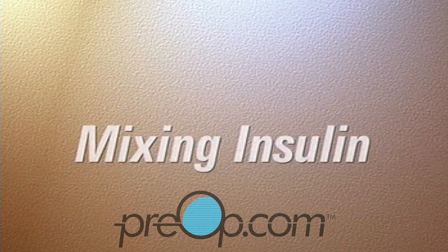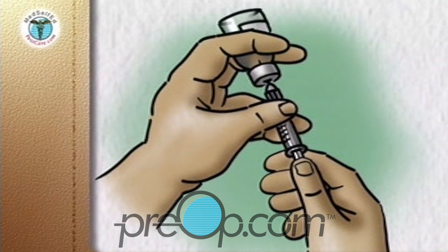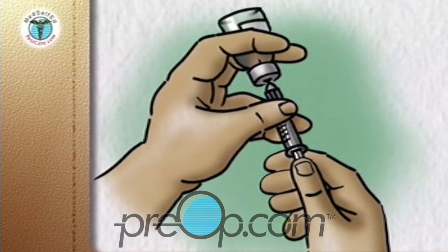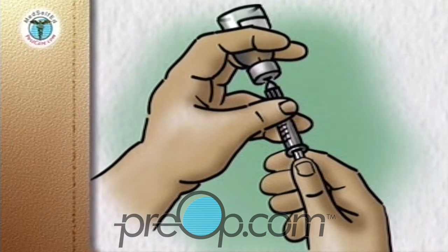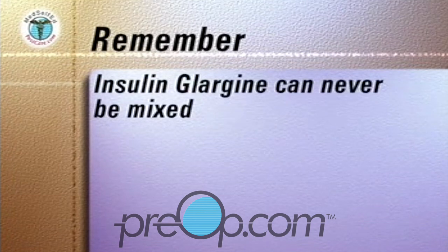Mix a short-acting or clear insulin with an intermediate or long-acting cloudy insulin in the same syringe so that both can be given at the same time. The only insulin that cannot be mixed is insulin glargine.